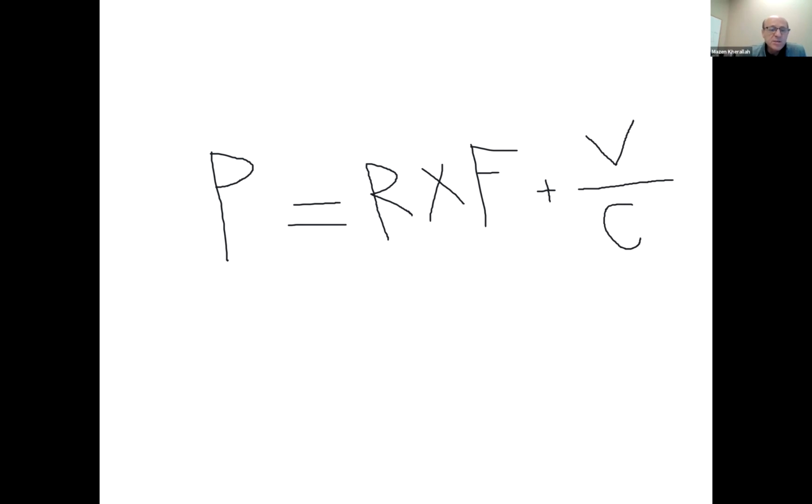Now, the pressure on the ventilator is actually variable based on how much the patient is going to participate also. Okay. And the pressure would be not only the ventilator pressure, but also the muscular pressure that is generated by the contraction of the respiratory muscles. So you need to combine these two pressures together in order to push that air into the lungs.